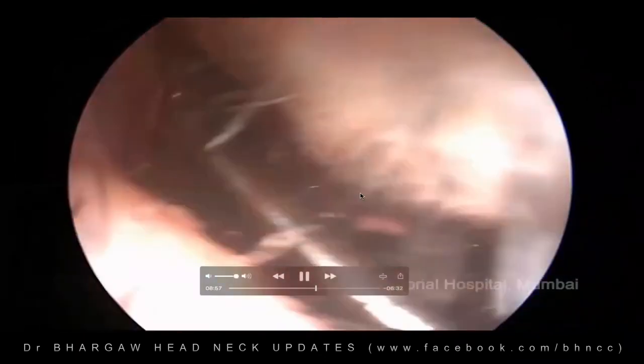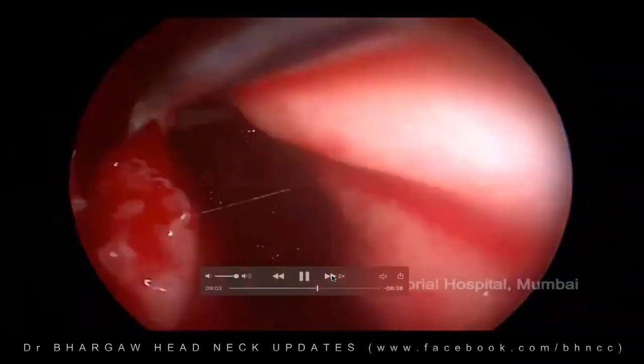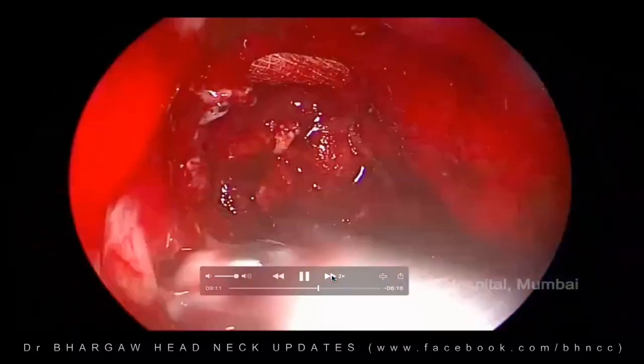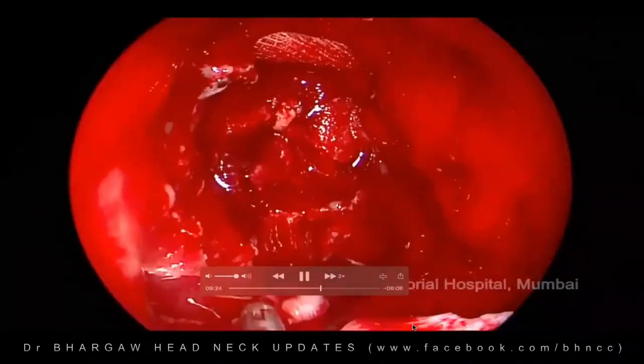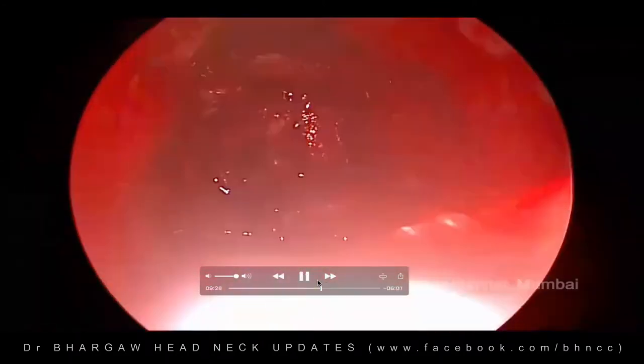So now we are removing the septum here. I'll just slowly fast forward it. We are removing the mucosa. That will be the anterior margin. So we have removed part of the mucosa. We are removing the septum here, right? And then we're doing the ethmoidectomy on the opposite side. So the septum has been totally removed. That's the ethmoidectomy on the opposite side, right?